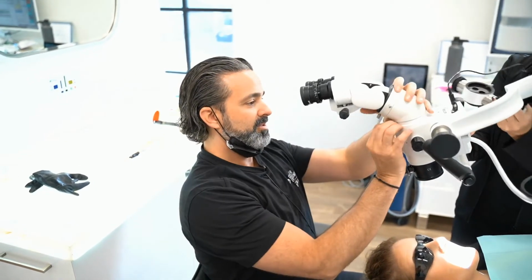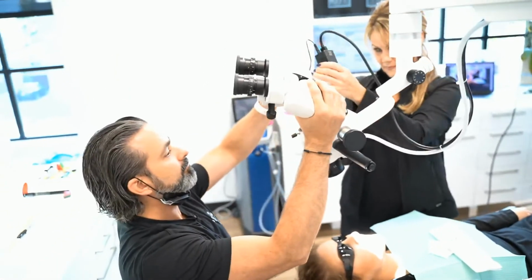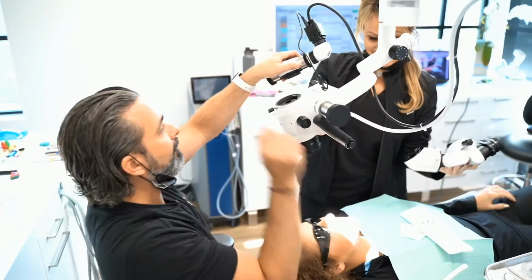Okay, so I'll put the beam splitter back on. Vicki, could you? Oh, never mind. Here, hold this.